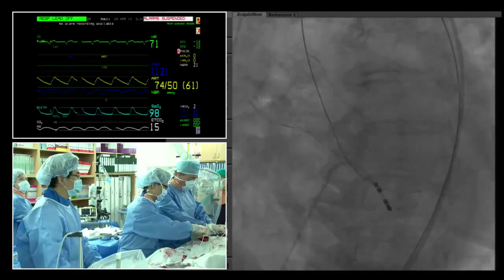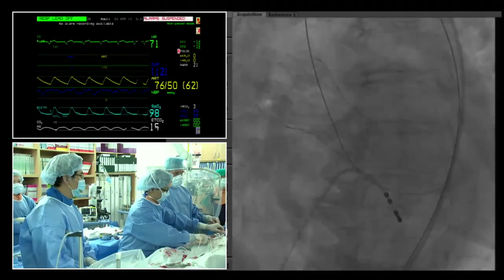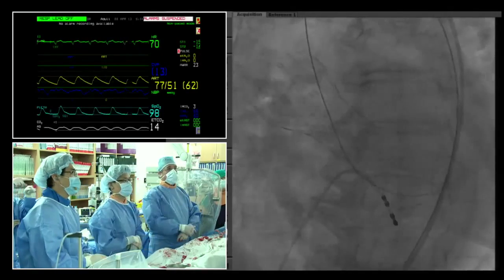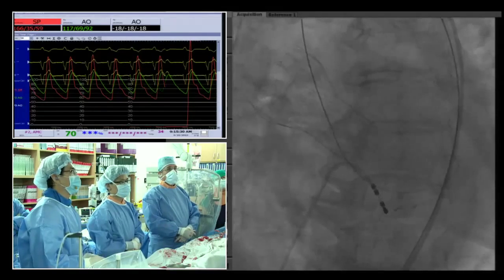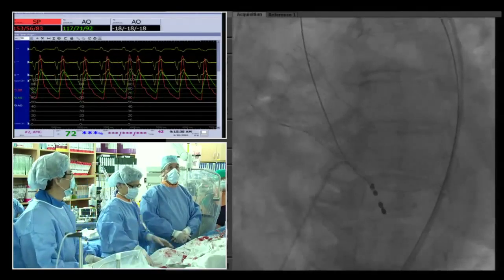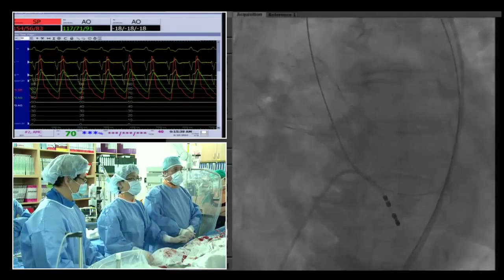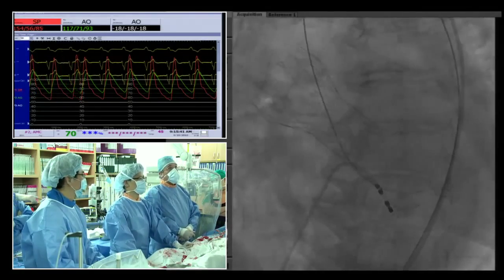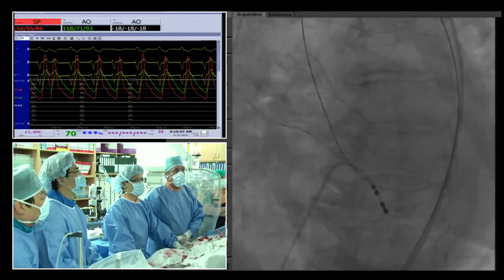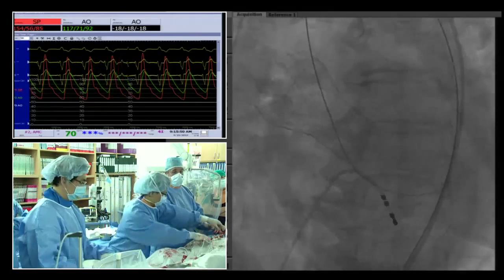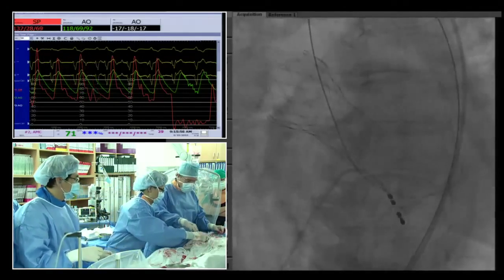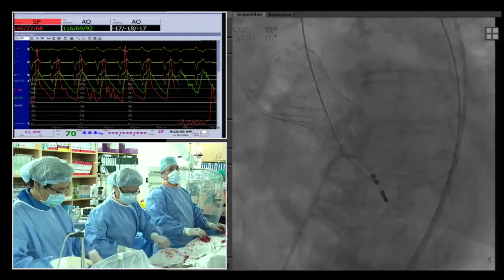The higher pressure reading is generally the better one; at 120 mmHg that is acceptable but there is uncertainty about the tracing — one line shows 160 which seems too high. Paul emphasizes the importance of following hemodynamics closely. The team will flush and re-zero to get a better hemodynamic measurement, including checking the end-diastolic pressure gradient.